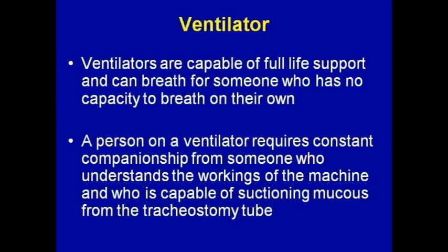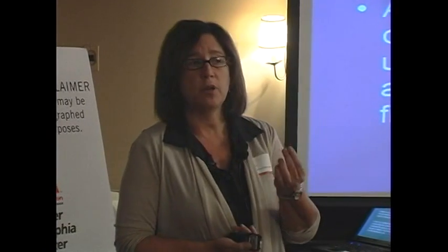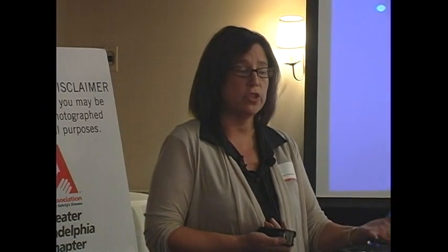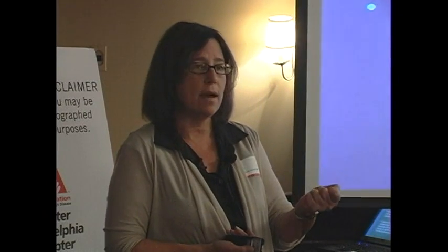The machines aren't complicated, but there's a learning curve, and they have alarms. For example, if the ventilator connection popped off the tracheostomy tube, an alarm would go off, and the person taking care of the patient would need to know what that alarm meant and respond to it and hook the person back up, because you could imagine if for some reason that popped off and it wasn't recognized and the person on the ventilator wasn't able to tell them, that could be a devastating consequence.